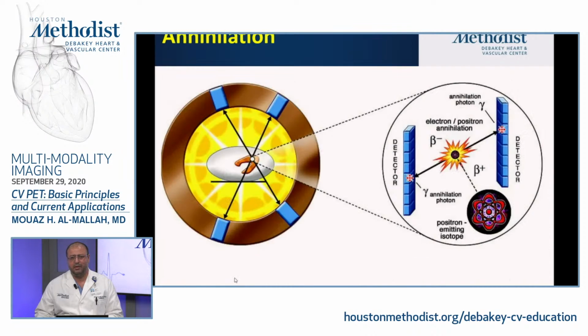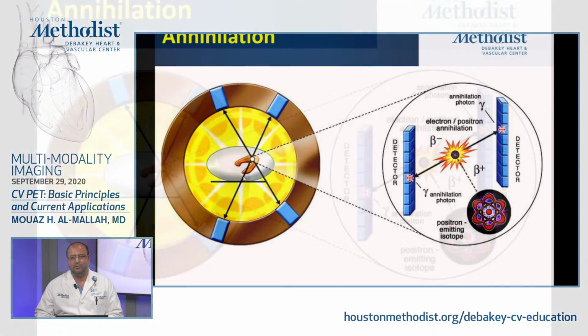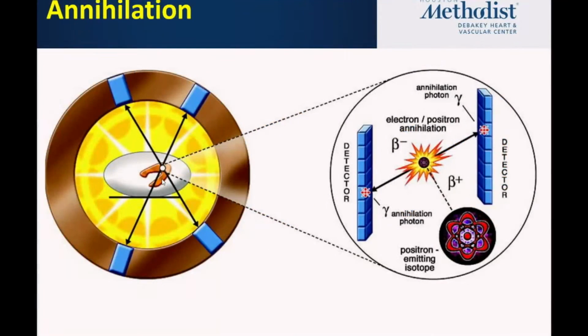So let's go back now to the truths and randoms, and just to cover all of these. So this is another description. The heart is in the middle. You get different truths, but they will be hitting also multiple detectors. So one of them could be going this way, hitting two detectors that are 180 degrees. Another one might hit these two detectors.